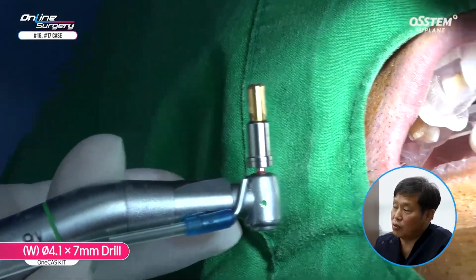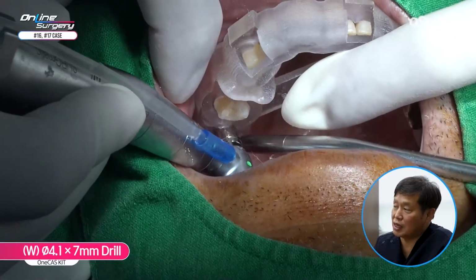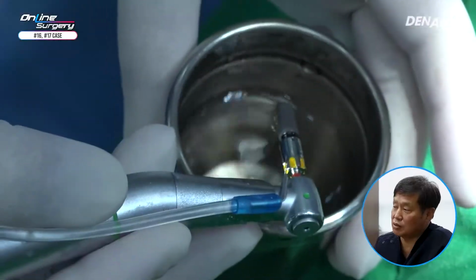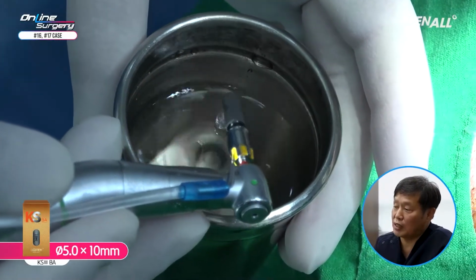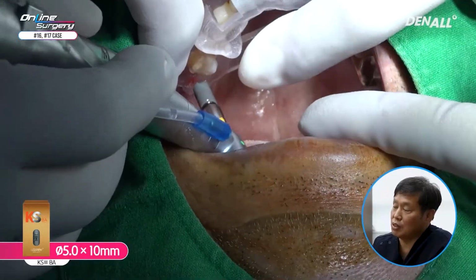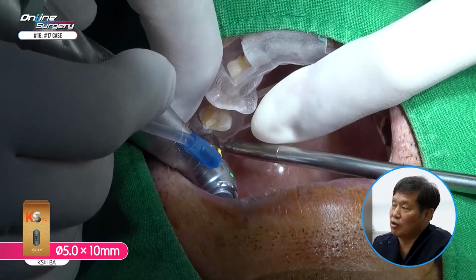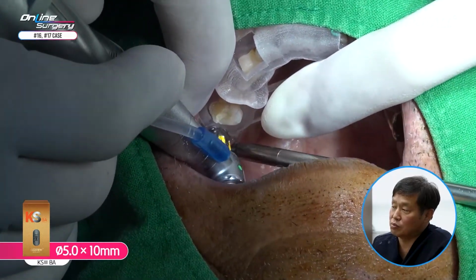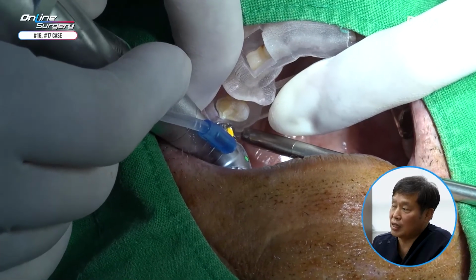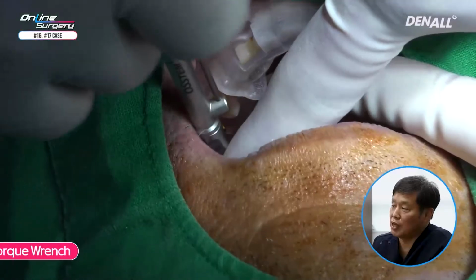So the drill hole is expanded up to 4.1. Drilling was done up to 7 millimeters, and with the bone graft material, the drill hole is expanded because of the density of bone. KS3 5.0 by 10 millimeter implant. The final drill is up to 4.1. Before placing the implant, the bone was harder than thought because of long-term inflammation. I think the septal bone area was harder.